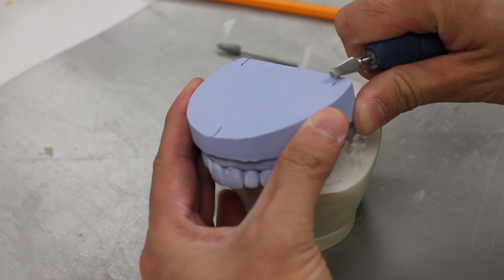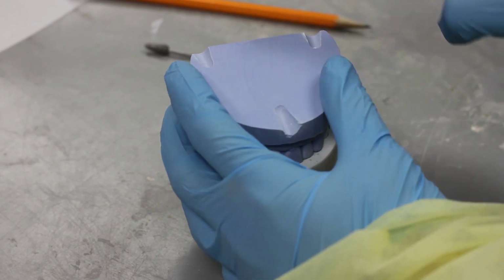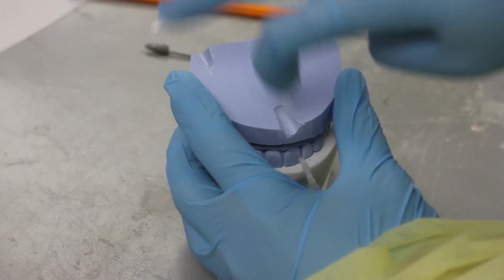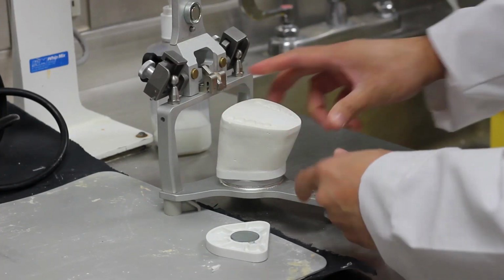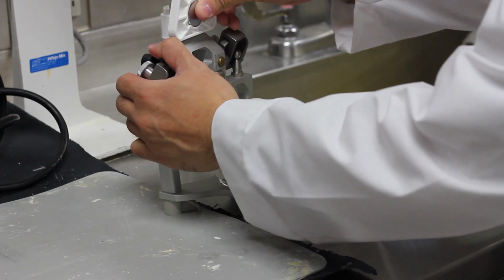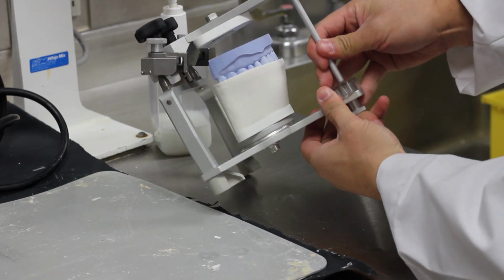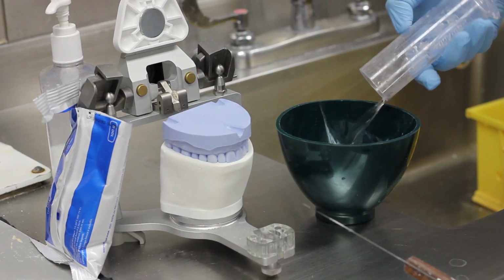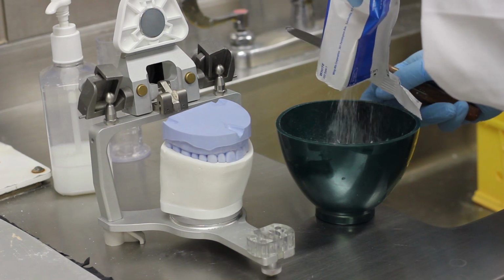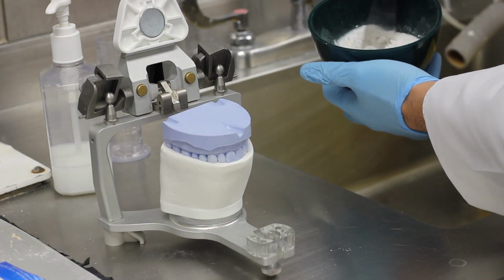So the next step is to mount your cast onto an articulator. And what we've done here is index your cast with a burr in 3 separate points and put a little Vaseline in there. And the purpose of that is if the cast ever falls off, you're able to re-index the cast to your mounting. So we've attached a mounting plate to the articulator, and the articulator simulates the opening and closing of your patient's mouth.